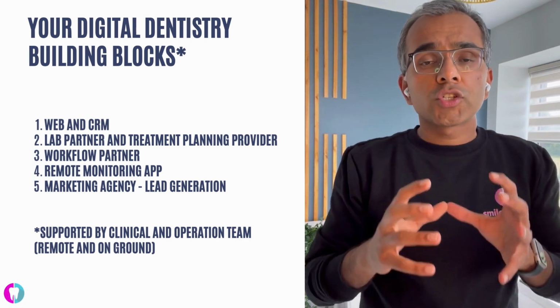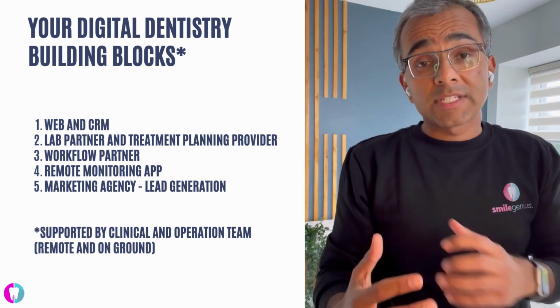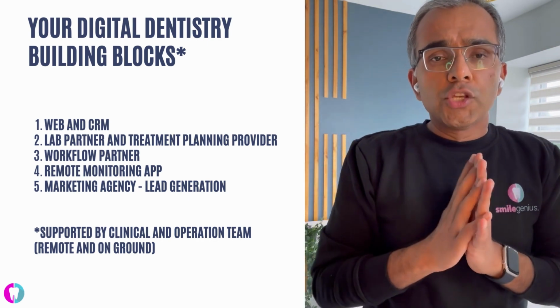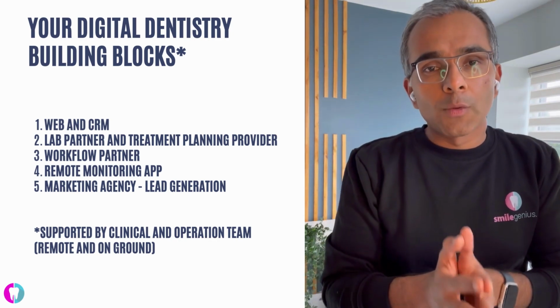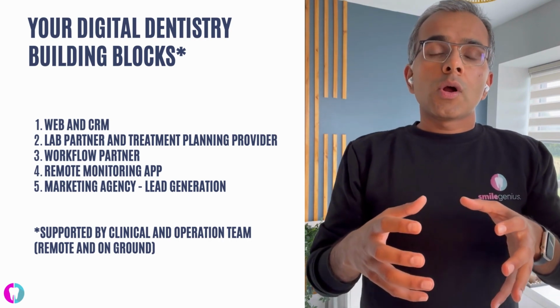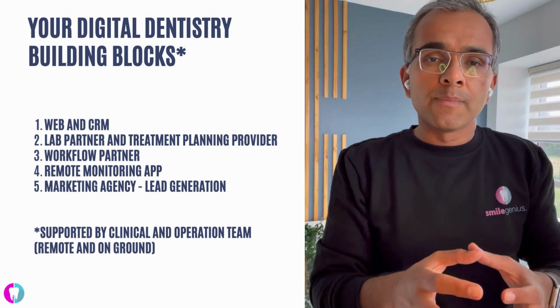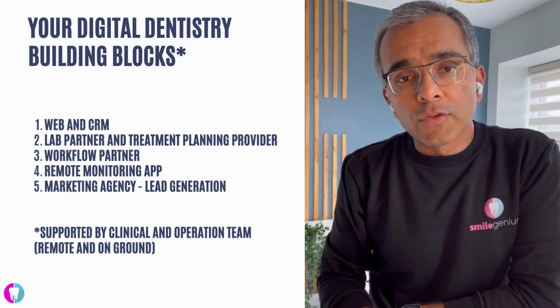Doing your research and talking to other people in the industry is a very important step that you can take. Once you have done that and you are talking to your manufacturer, you need to ask them whether they will be doing the treatment planning for you and what the package for the treatment planning would be. Because treatment planning might seem one of the smaller steps, but it's the most important step, because the final outcome of the treatment is solely dependent on the quality of the treatment plan.